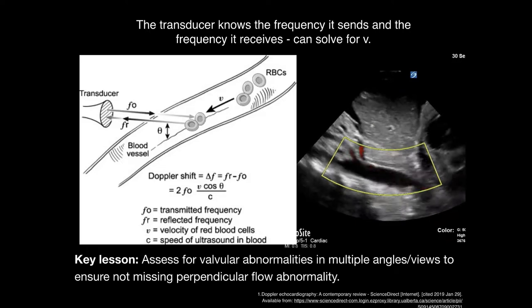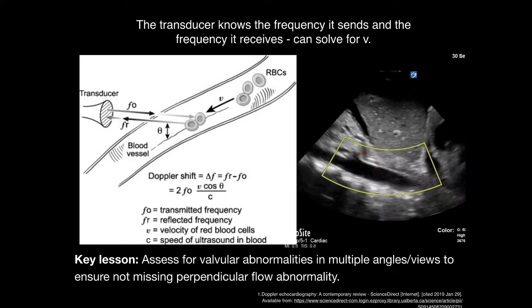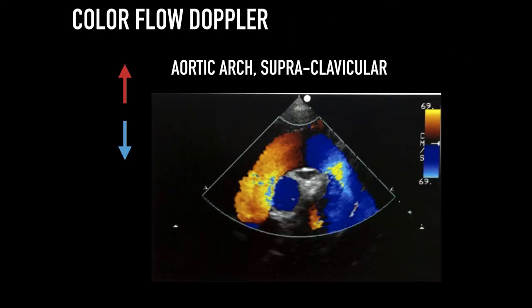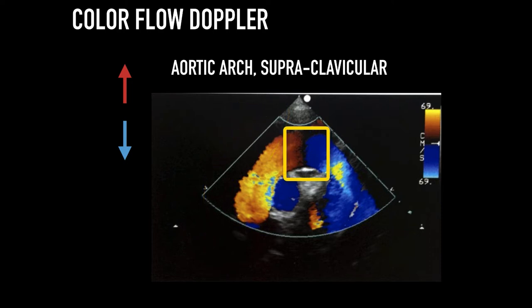The key lesson is to assess for valve abnormalities in multiple angles and views to ensure you are not missing perpendicular flow abnormalities. In this image, the flow is going towards the top of the aortic arch. The color intensity drops and becomes darker until it becomes black. There is definite blood flow in those regions, but the Doppler shift cannot be picked up because it is perpendicular to the ultrasound beam.